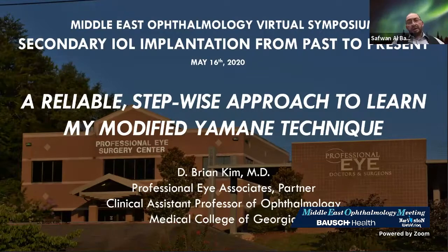But now, Dr. Muhammad, just one minute, if you don't mind. When we are saying endophthalmitis here, why are we separating it from cataract surgery? What's the difference? I'm not seeing that. I don't know whether Carlos agrees with me and Brian Kim. There's no difference here between usual cataract surgery and the secondary IOL implantation. It's an implantation, but we are going out and in. So I think that the rate will be the same.